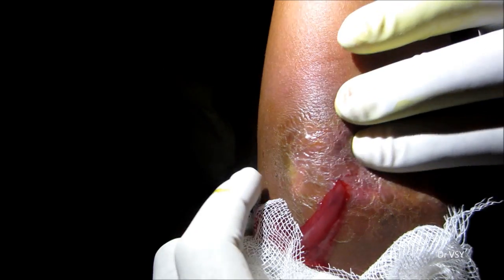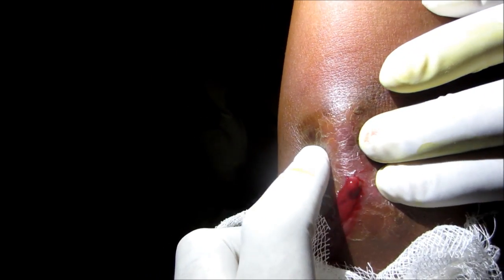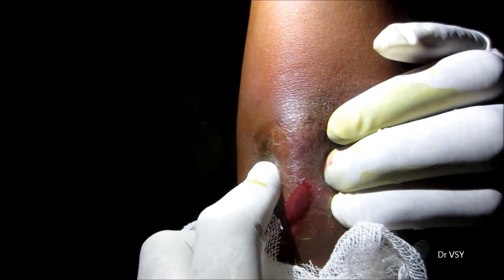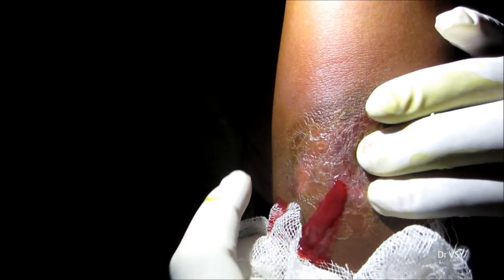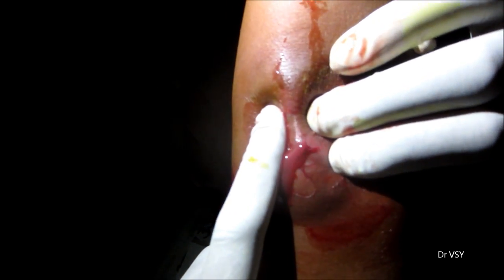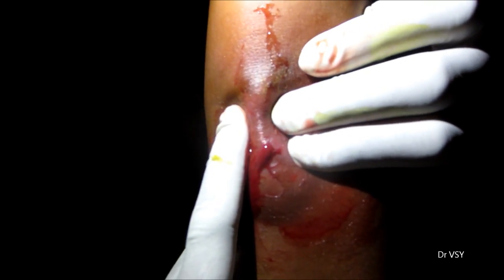Now insert your finger inside the cavity to break all the loculations so that all of the pus can be drained out. Then clean the cavity with normal saline, hydrogen peroxide, normal saline, and betadine.